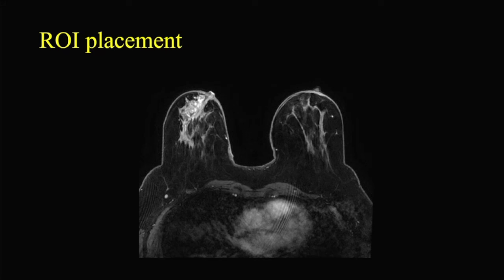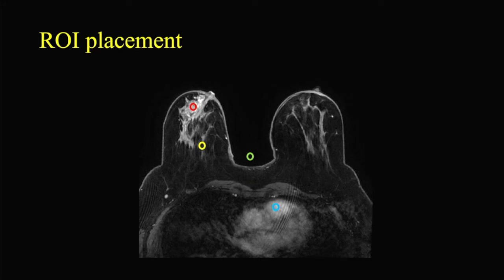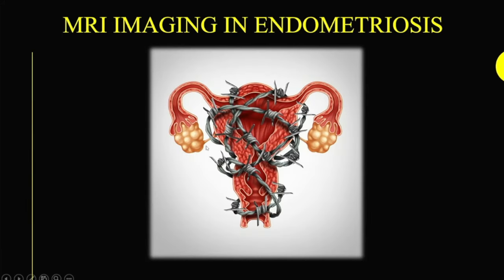For documentation, you place regions of interest (ROIs) at four locations: first, the lesion itself to show the enhancement kinetics; second, normal breast parenchyma for comparison; third, air as a control — it should show a flat curve, confirming no wrong analysis; and fourth, the heart or aorta as another control to confirm proper contrast injection. These four ROI placements give you ideal graphs to comment upon the enhancement curves. This completes the overview of Kool's kinetics curve.